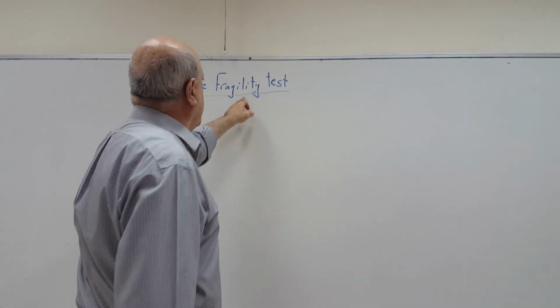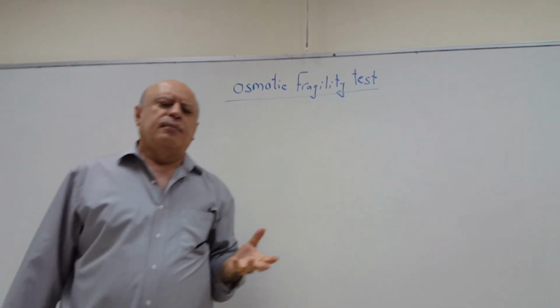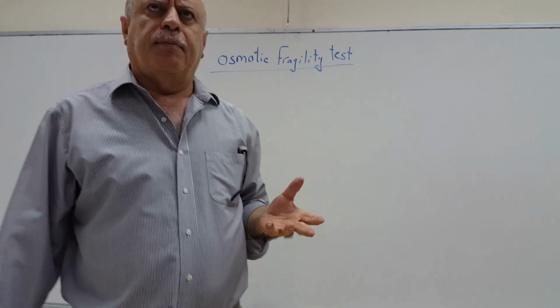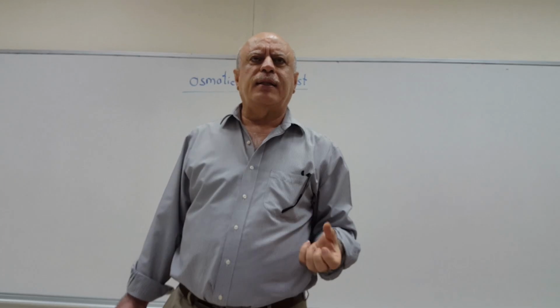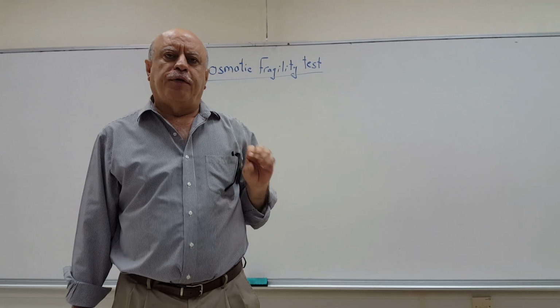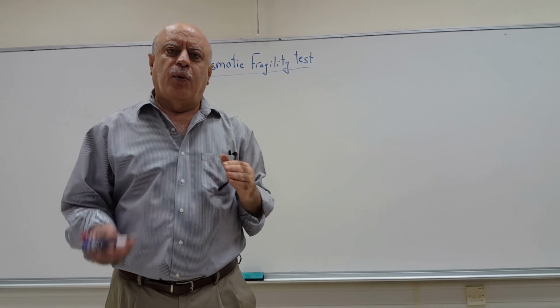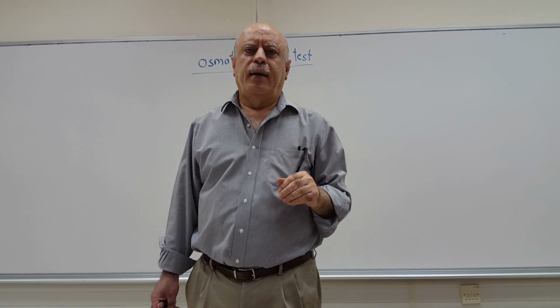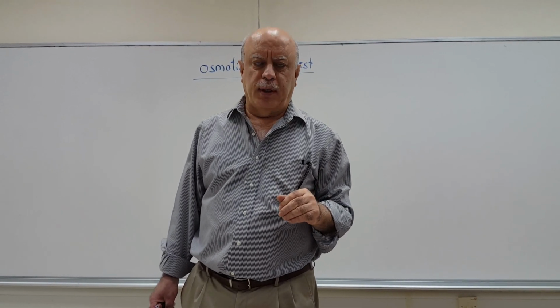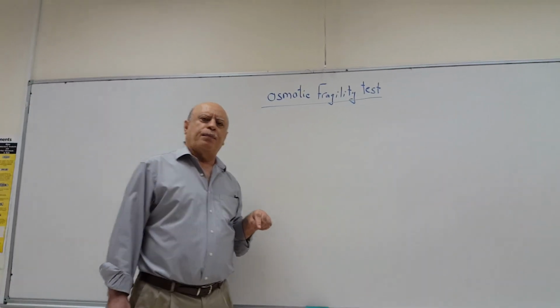Osmotic fragility test. This test is not very often ordered, but when it's ordered, it tests the ability of the red blood cells to resist lysing when placed in a hypotonic solution. Let's go over what a hypotonic solution is.